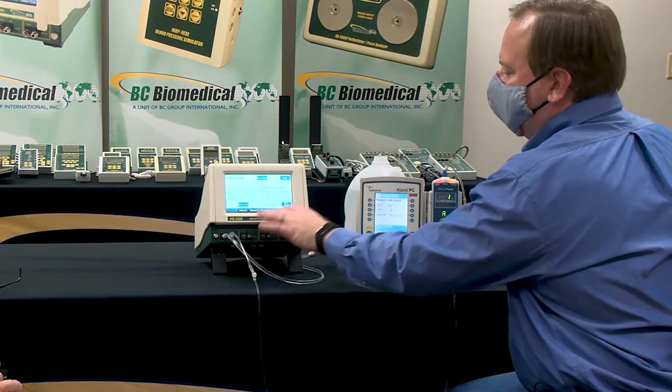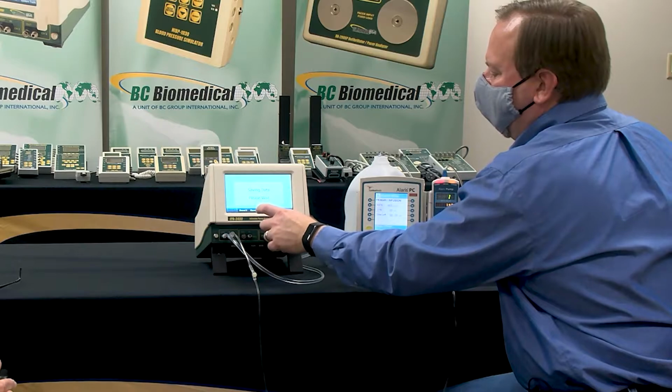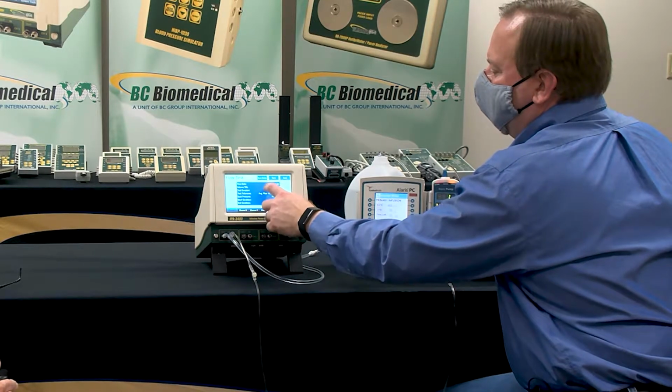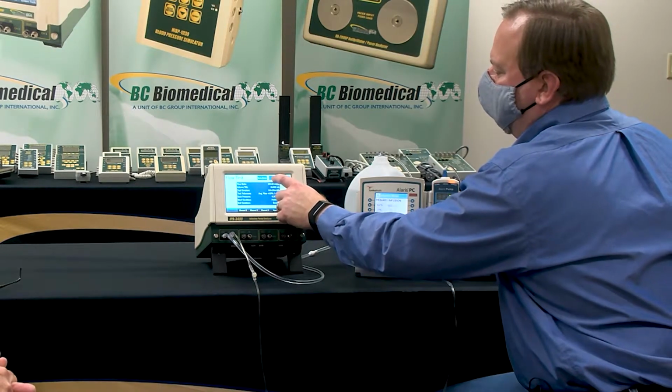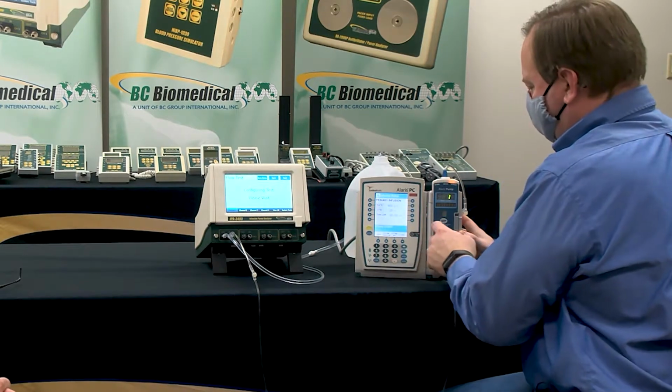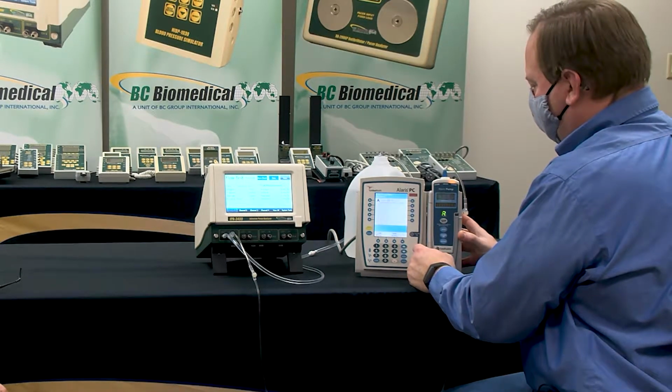Okay, so we saw our pressure was around 0.2, right? That was our setting. So I'm going to change this for, you know what? Let's just leave it at 100. Let's see what happens. Start. Restart. Start here. 600.